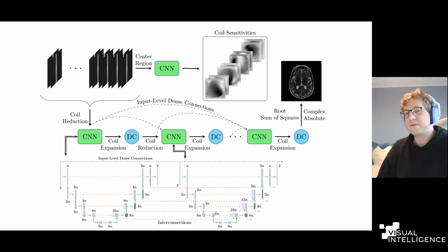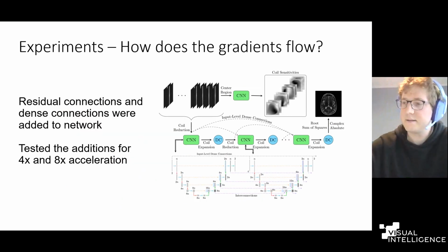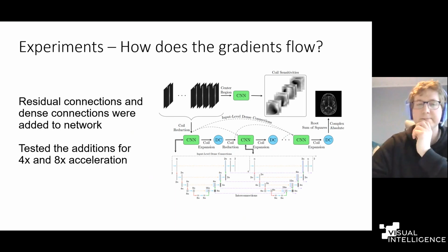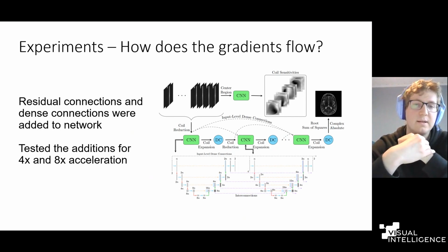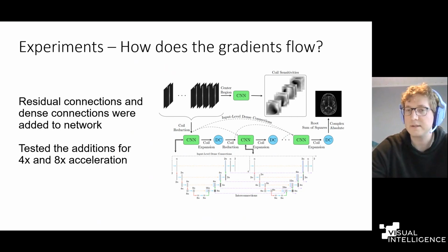It's the reconstructed image of how you want it to look. So that is the general flow of how an MR reconstruction model works. This is how it is used and how it's implemented.